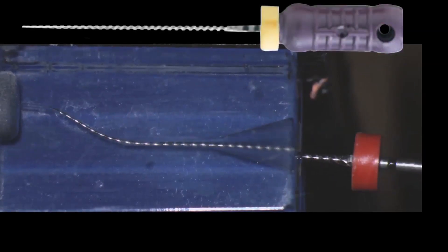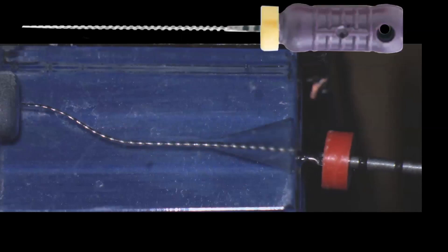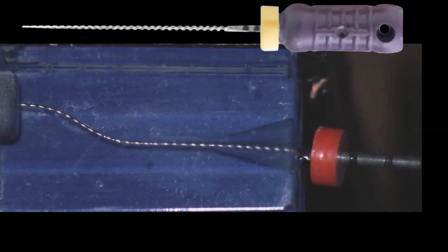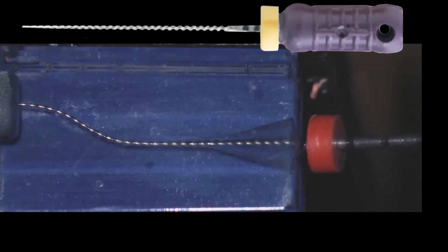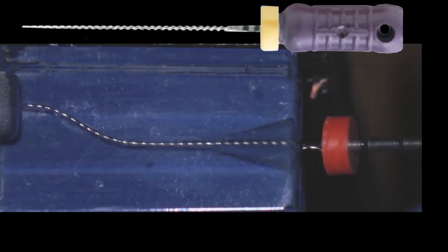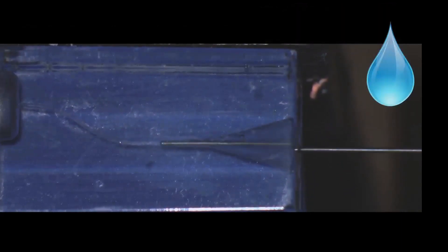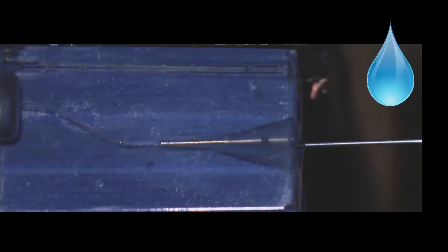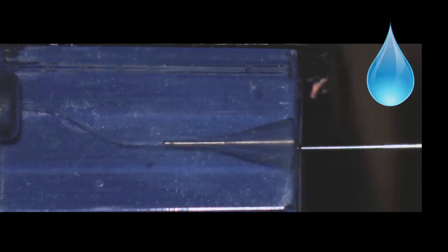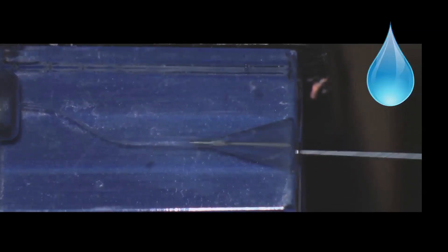We are going to go with a very fine instrument, a number 8 or number 10, to see that we are able to go a little bit beyond the apex — not that much, just half a millimeter to a millimeter. We irrigate again. Every time that a file is used inside a canal, it requires irrigation. You can see here how far the irrigation needle goes.